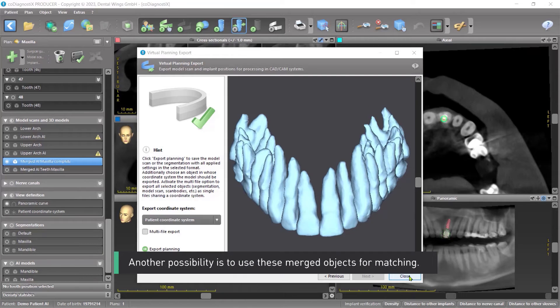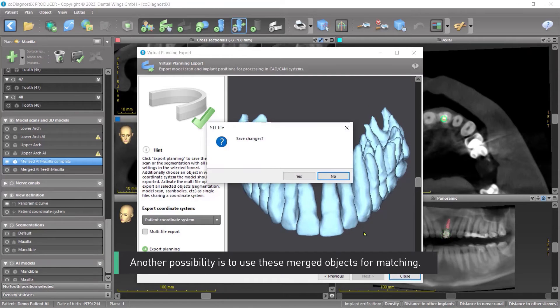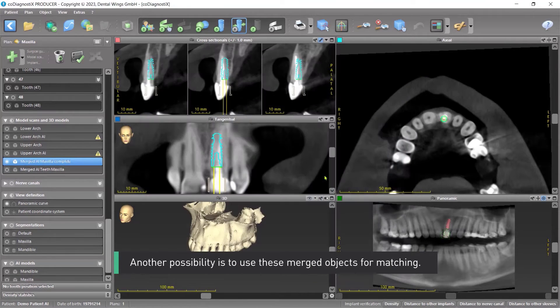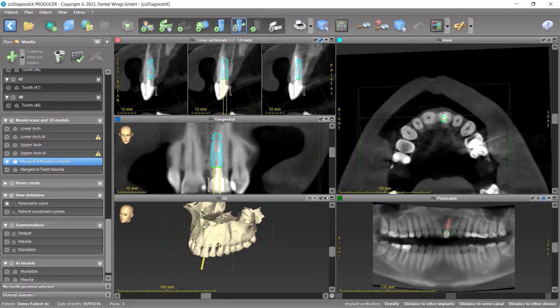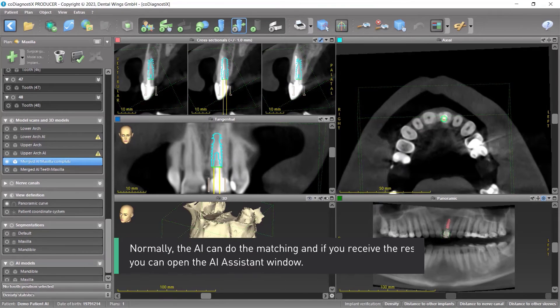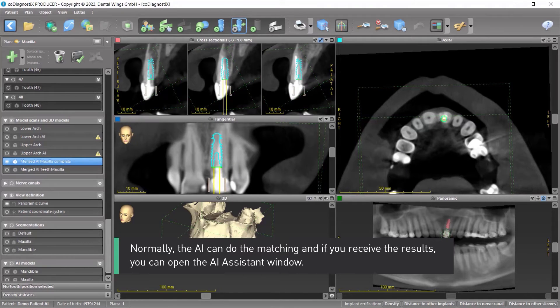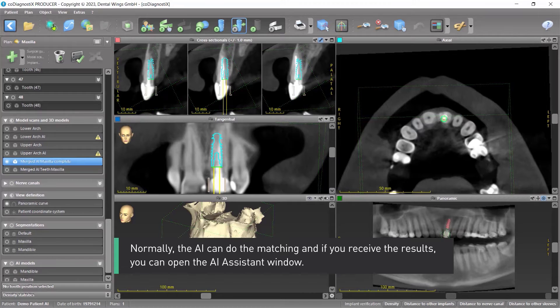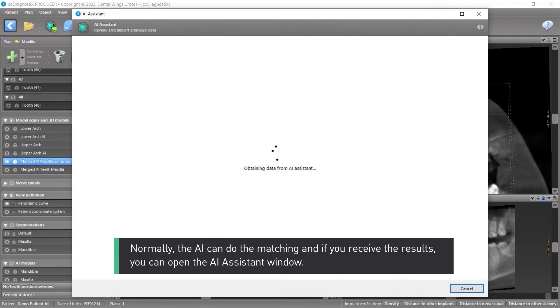Another possibility is to use these merged objects for matching. Normally, the AI can do the matching. And if you receive the results, you can open the AI Assistant window.